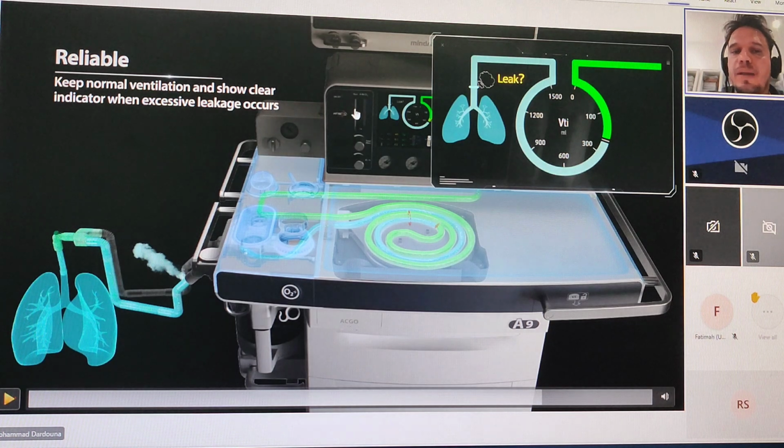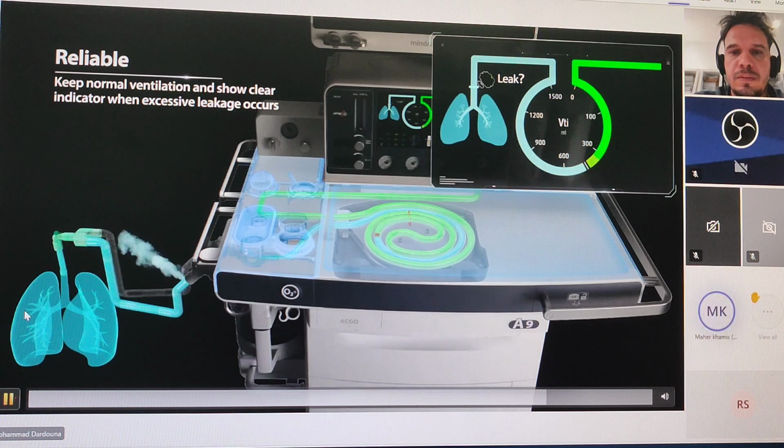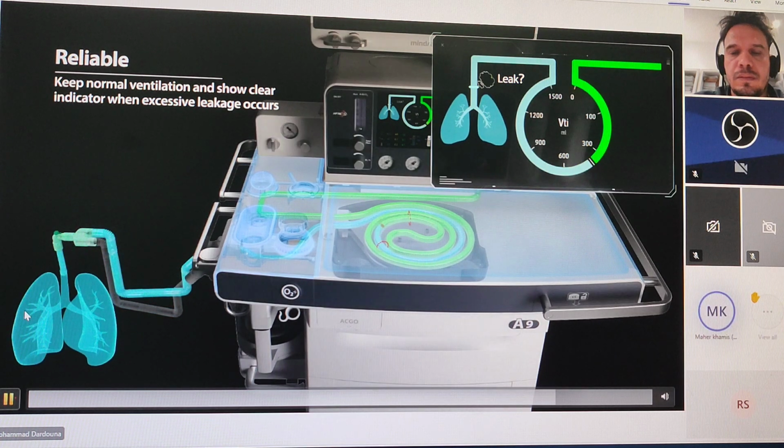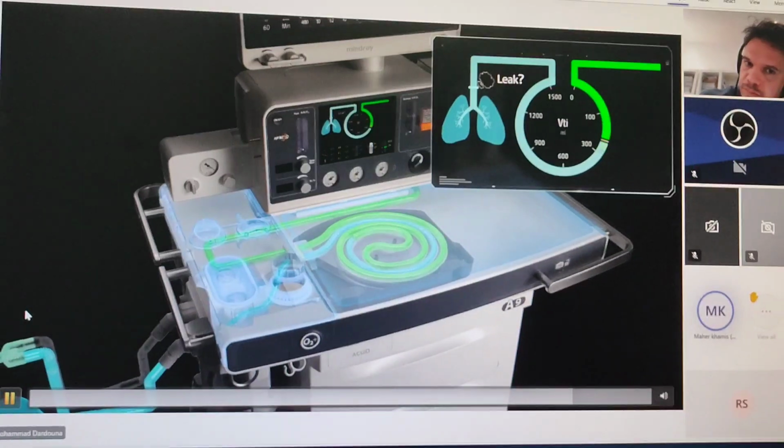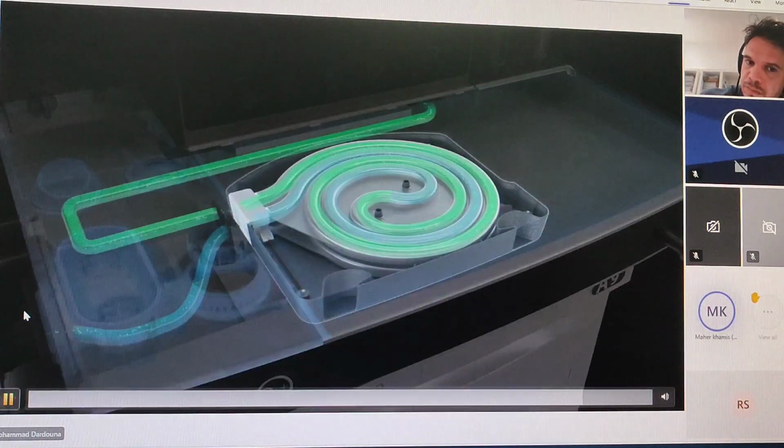So the doctor will be aware that there is some leakage problem and will try to fix the tubing or whatever, but they will continue the surgery. This indicates that the machine will consume more gases to compensate for this leakage. It will look exactly like this on the administrator screen. Clear? It compensates, so the gas consumption value will go up. That's the effect.